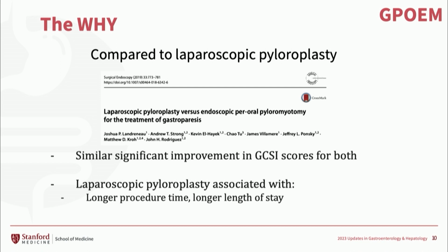Now, when compared to laparoscopic pyloroplasty or robotic pyloroplasty, there was similar significant improvement of the GCSI scores for both modalities. So again, very comparable, whereas laparoscopic pyloroplasty was associated with longer procedure times and longer hospital stays.